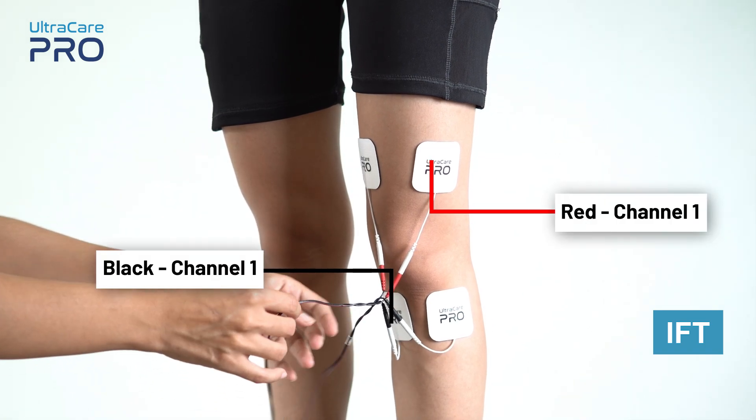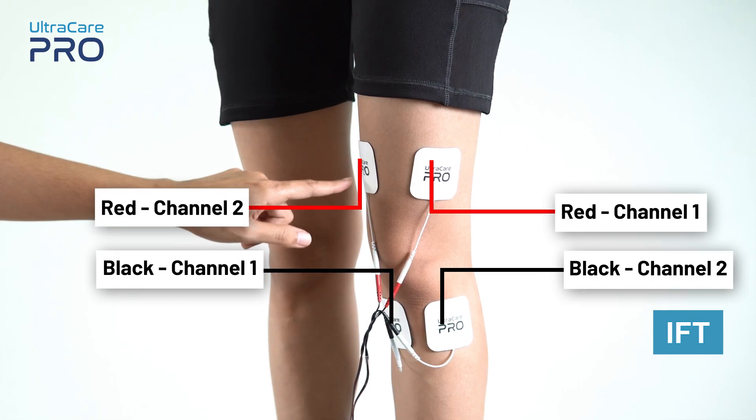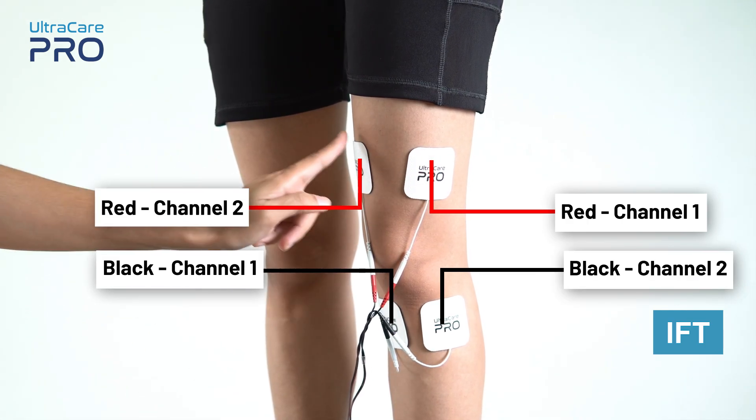For IFT application, place the red and black electrode from channel 1 in a diagonally opposite pattern. Similarly, place the red and black electrode from channel 2 in a diagonally opposite pattern, so that a cross pattern is made. Once the electrodes are placed, the device is ready for parameter setup. For other body placements, check our Combo 3 Plus placement series.